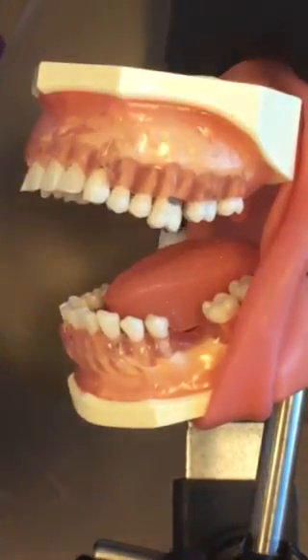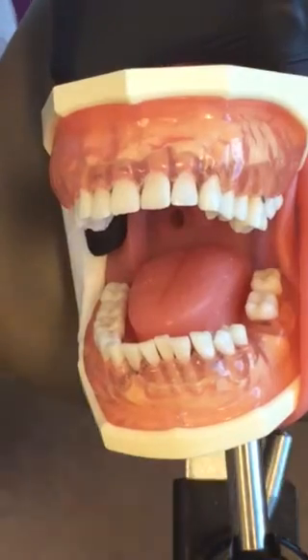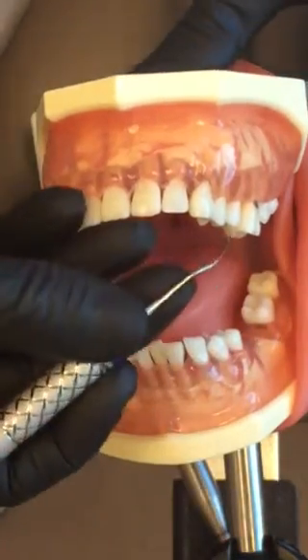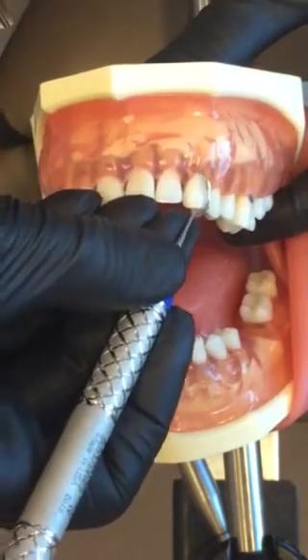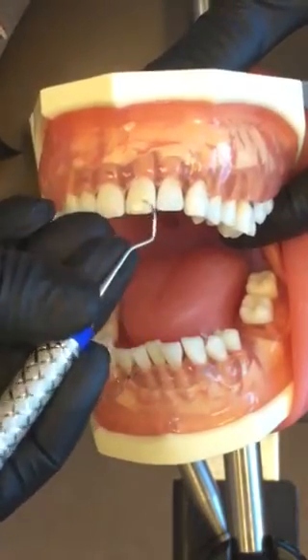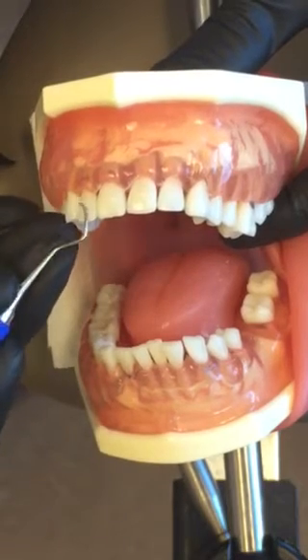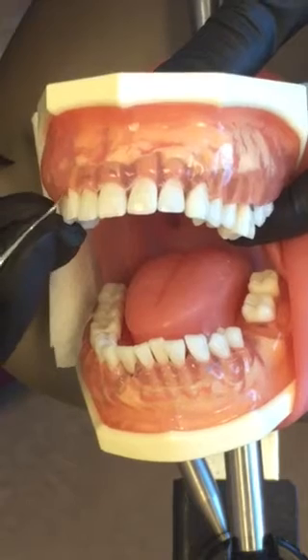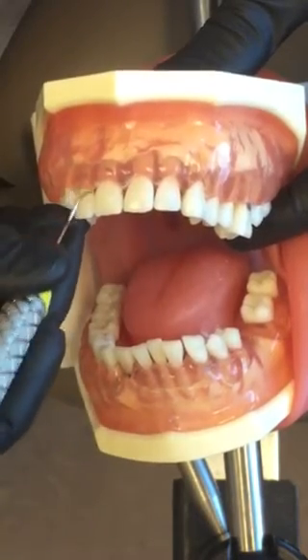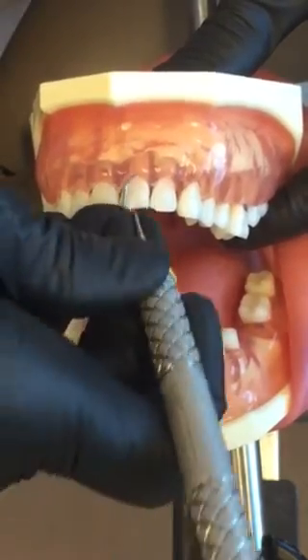With this 13-14 you can also use it on the anterior. I would have my patient turn more central and slide around to 12 o'clock. The end that worked on my upper left will now work for surfaces towards me. Starting at the midline of the canine, do surfaces towards me keeping the terminal shank very parallel to the tooth. I'm in a palm-up hand position, making sure I'm leaving space between my thumb and finger to roll the instrument. I can do this canine to canine. Now I flip my instrument and I can do surfaces away from me, starting at midline.